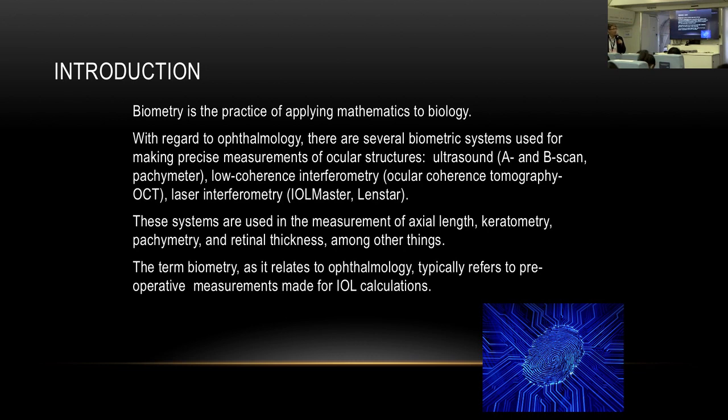But typically in an ophthalmology practice, when you hear the word biometry, it typically means or is referring to the preoperative measurements that we do for IOL calculations, before we do cataract surgery on a patient.